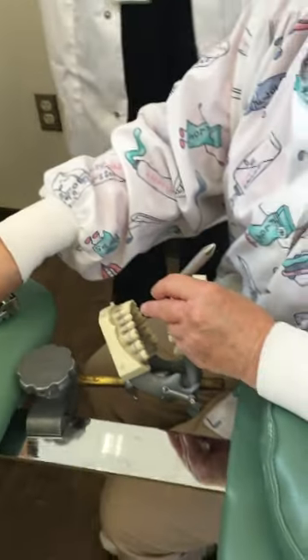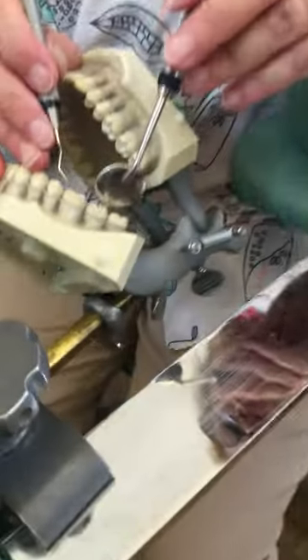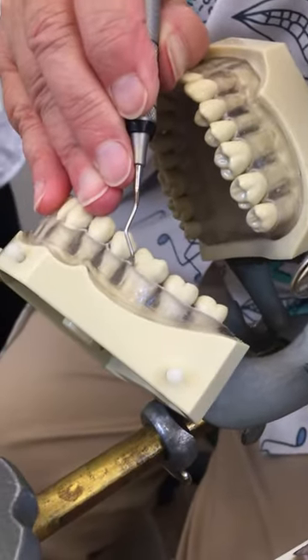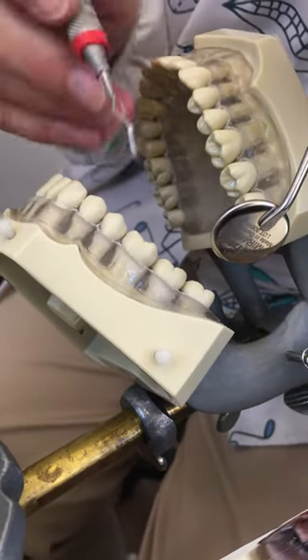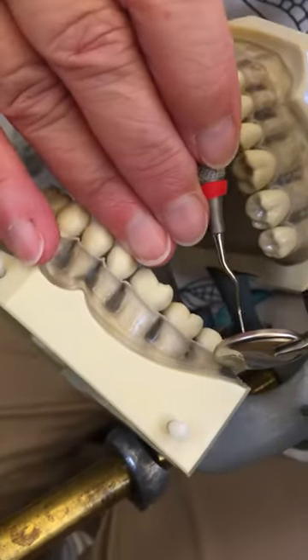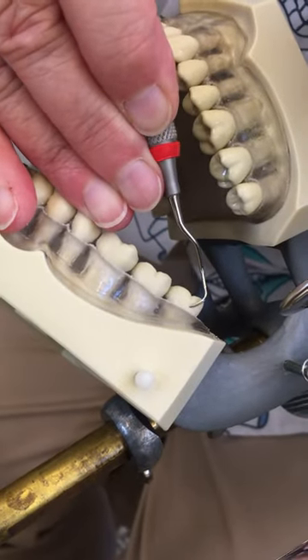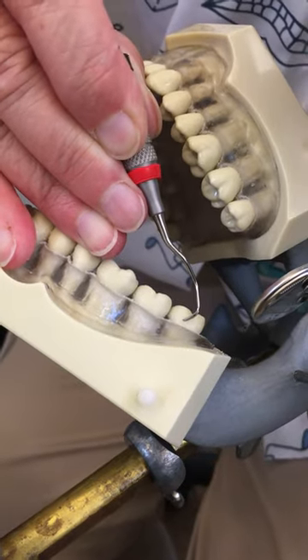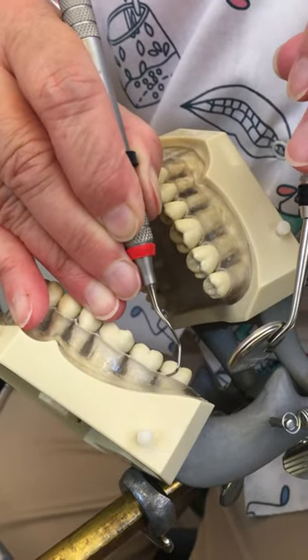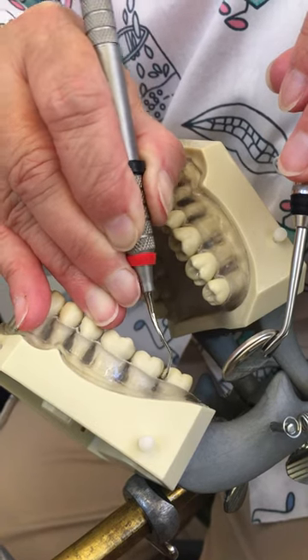Now I'm going to go back to my 15/16, which is used in the mesial direction. I'm going to check it on the mesial, coming across the arch and placing it just on the mesial surface. Now I'm going to start at the distal line angle, pull enclosed and then open slightly. I'm using my mirror to retract the cheek to see around any part of the tooth that I need to, with indirect vision or for illumination.